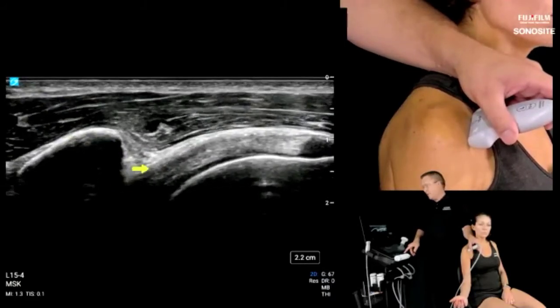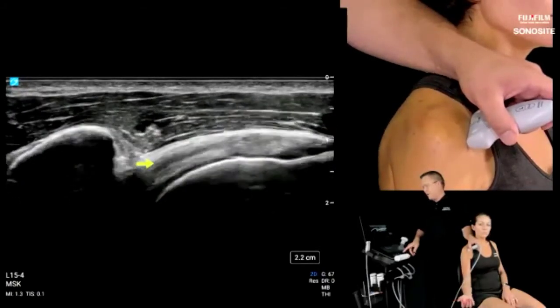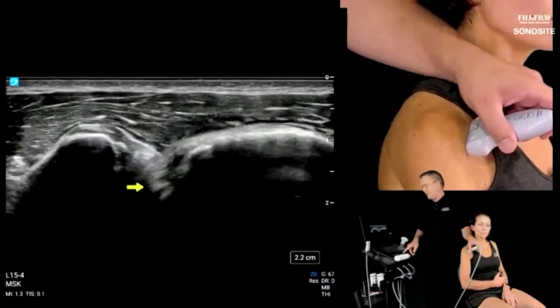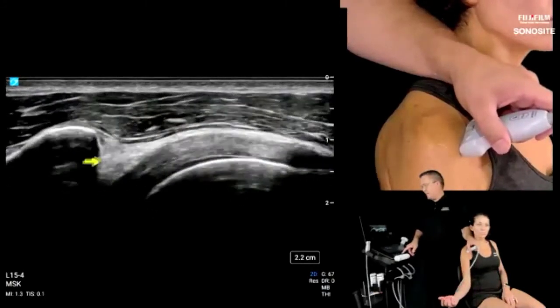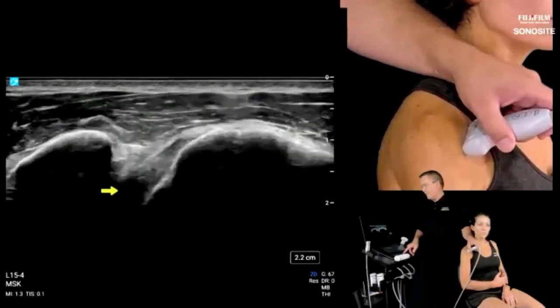And now we're going to look for this interface. Much like we just did the subacromial, we're going to slowly internally and externally rotate. And she's going to go all the way in until the lesser tuberosity clears the coracoid. And let's externally rotate again. And I didn't see the lesser tuberosity clunk into the coracoid or its surrounding connective tissue right here. And that's moving nice and free.